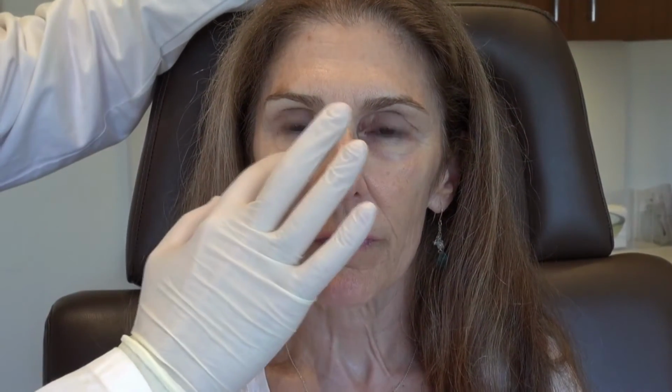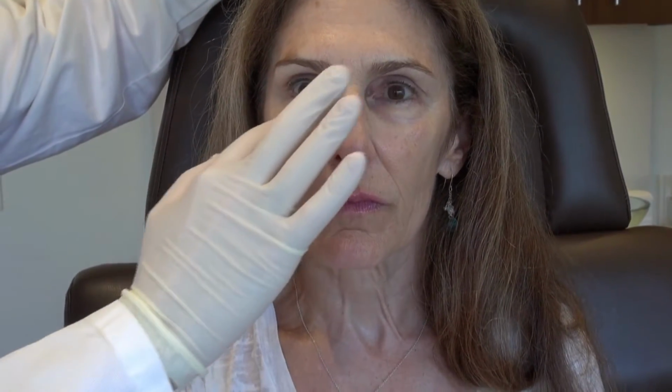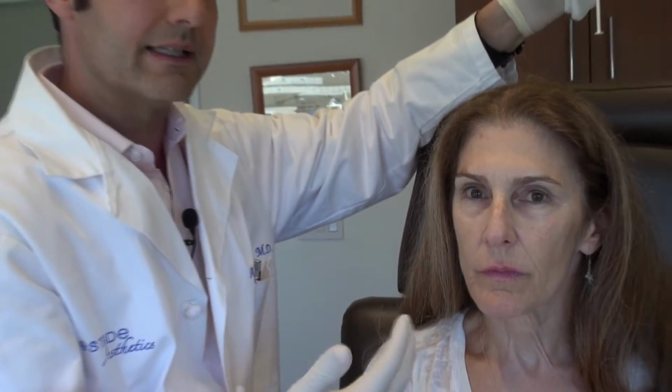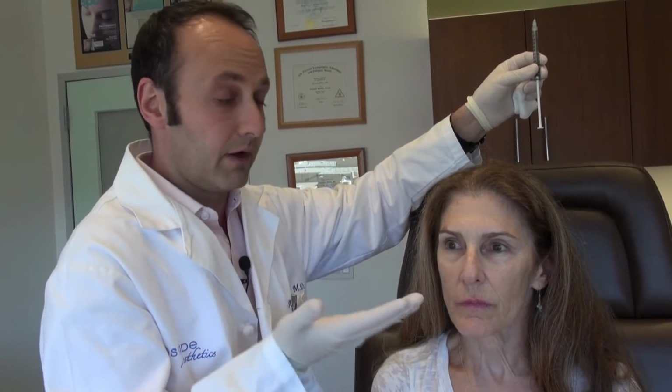In order to make this as safe a procedure as possible, I like to go right on top of the bone, on top of the orbital rim, and place the filler in that plane. Number one, I am lessening the chances of the Tyndall effect, and number two, I'm also lessening the chance of encountering any major vessels in that area, since I know they're going to be above me.